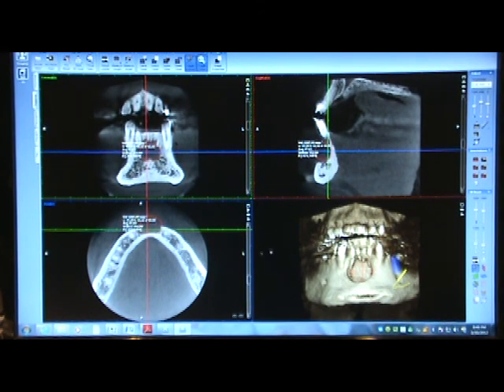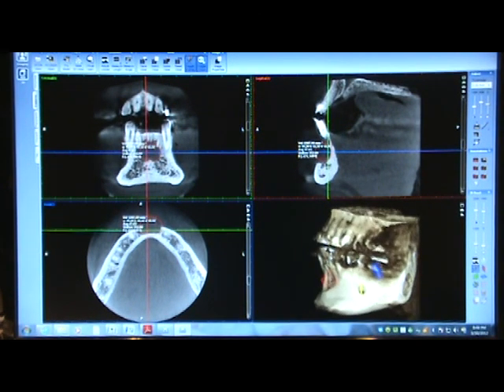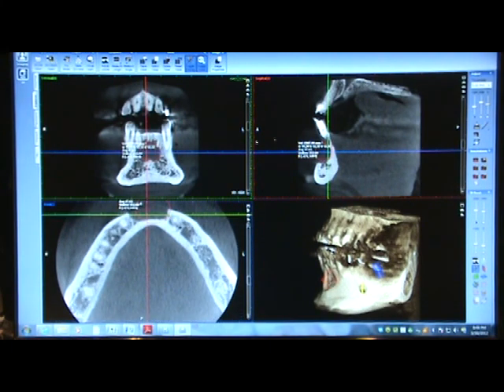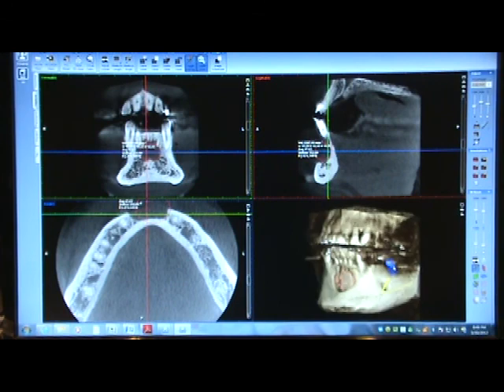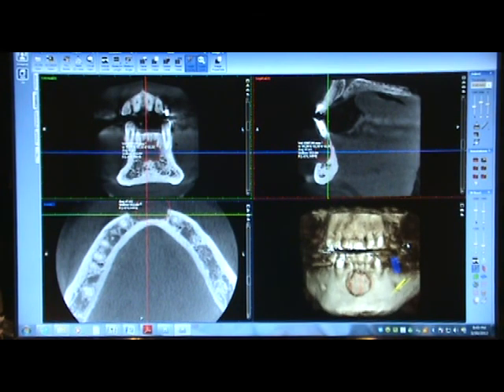I hope that was helpful. Again, I chose Planmeca because of the tremendous detail that you see in all the images and the diversity in the software that allows us to view in detail. And one of the really best things is that the software actually keeps getting better with upgrades that come every 4 to 6 months. Really makes a nice difference.